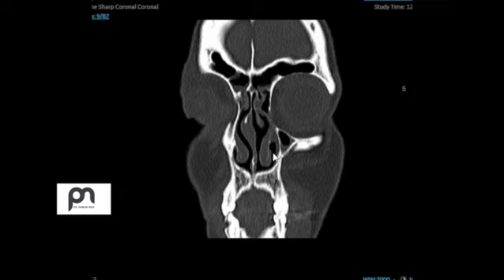By this movement, you're fracturing the inferior turbinate. We should take care not to cause much injury in this area. Nothing happens at that time, but later on it can cause fibrosis and obstruction.